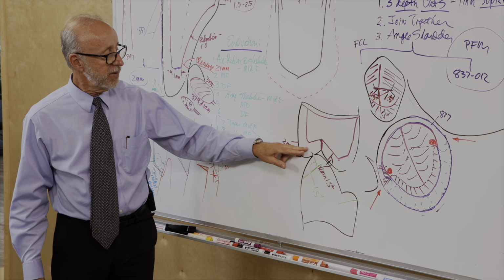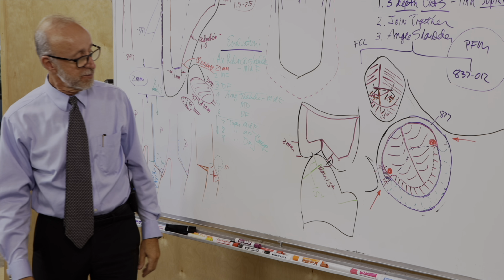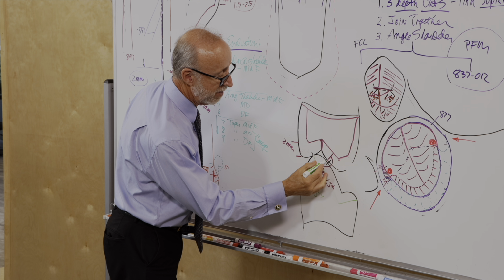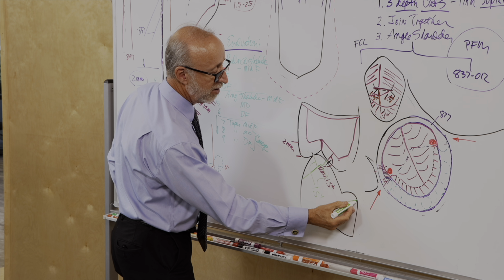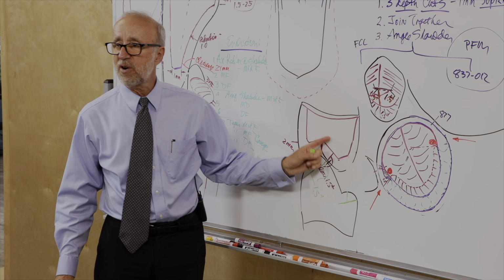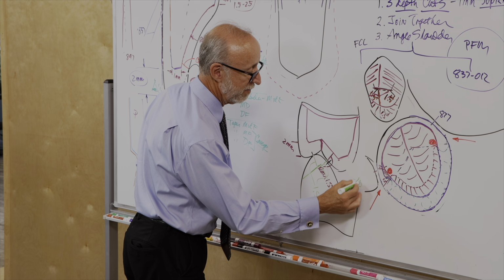It's not the same kind of thing that we have for a facial cusp and sizable edges and facial cusp up here where there's light going through those areas. This is just, you know, do they look white or not on the lower teeth? So get enough clearance here, get enough clearance on the other side as well, 1.5 plus. If we're reducing a lower first premolar, we want to get lots of reduction on that lingual cusp. Don't under-reduce it just because it's so far from the opposing tooth. We're not looking at clearance at all. So just reduce it 1.5 millimeters or so.